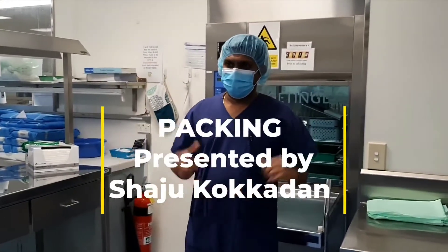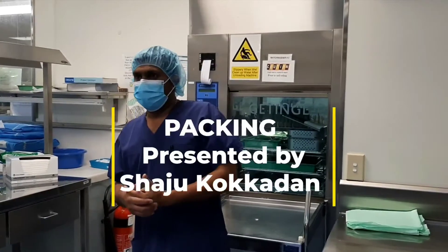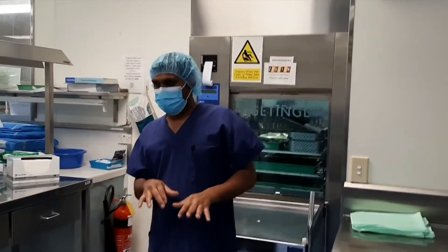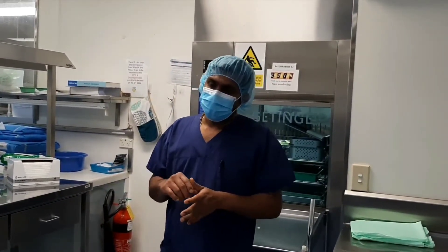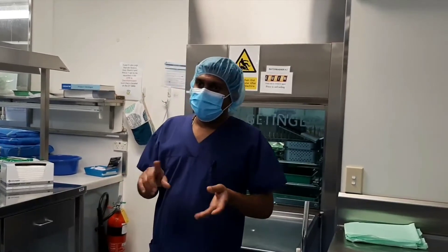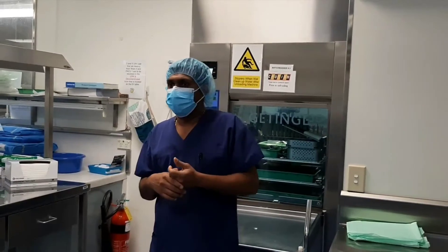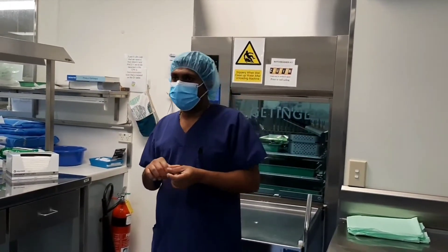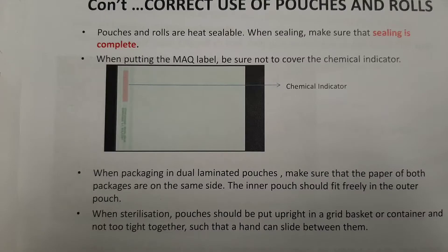Kia ora. Today I would like to talk to you about how to package a reusable medical device safely in a sterilization pouch. A well-designed and correctly used sterilization pouch allows for effective sterilization, safe handling, and storage of all pouched items until needed for use. In addition to protecting items through this process, they also facilitate proper aseptic presentation of devices in an operating room.